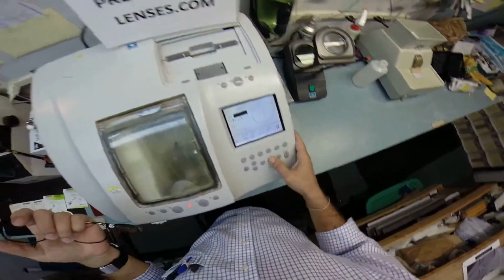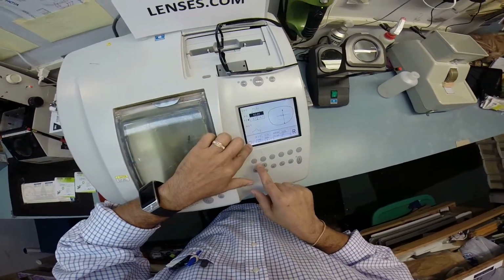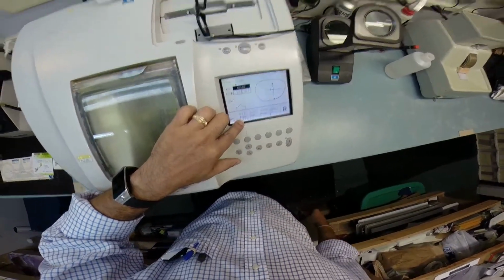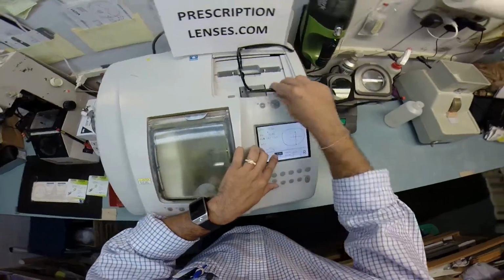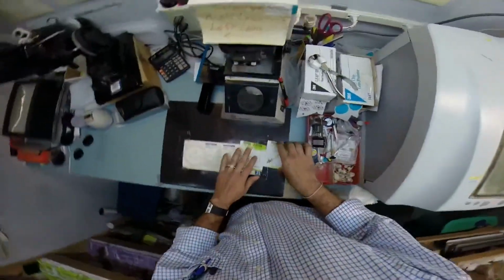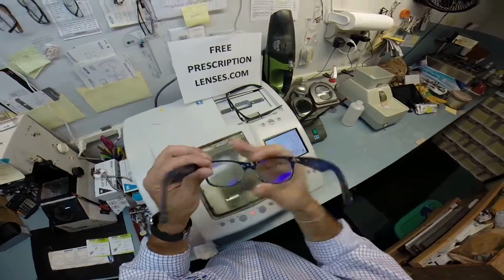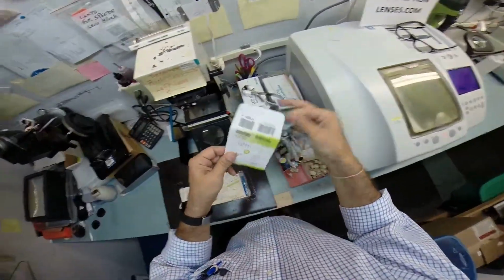So I've pulled up the shape on the computer. I'm just going to put in a couple of measurements. These are the polycarbonate lenses being cut for a Zyl frame, which is just an old school name for plastic. Plus, one thing I know about the 55mm frame is I need to take it down about 1/4 of a millimeter to begin with. I may have to do more. Now, I wear the same frame in the 52 eye size, which cuts true as can be, but the 55 is way more popular worldwide.